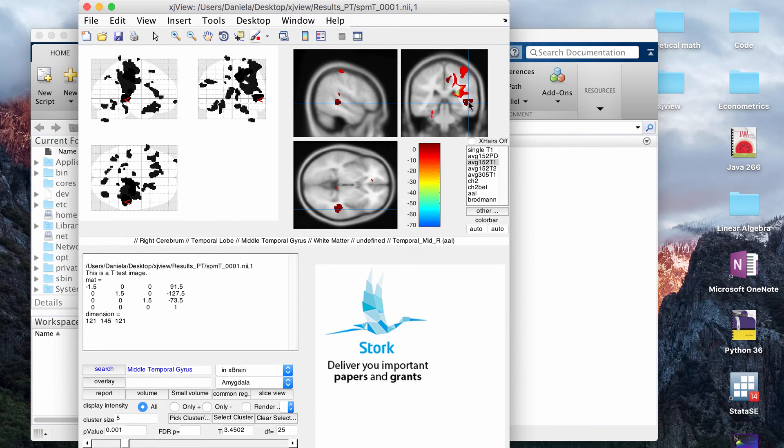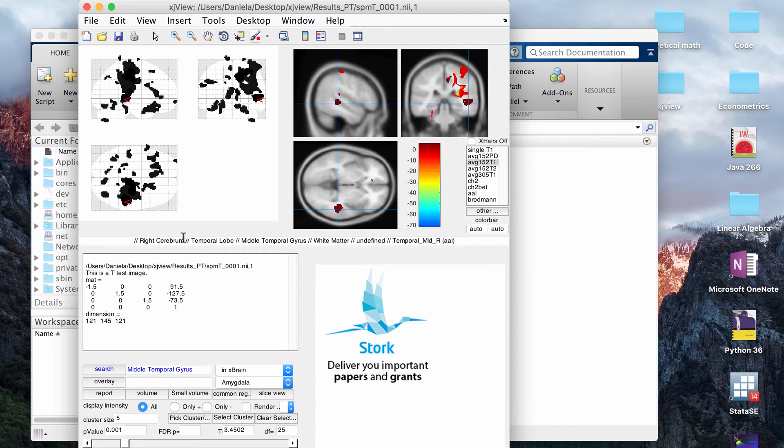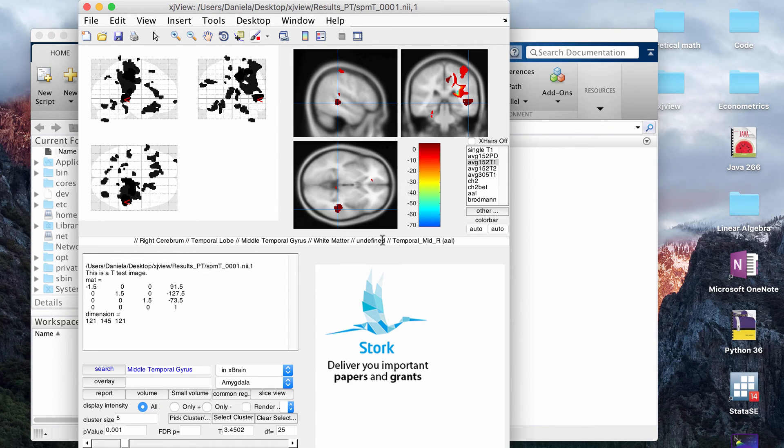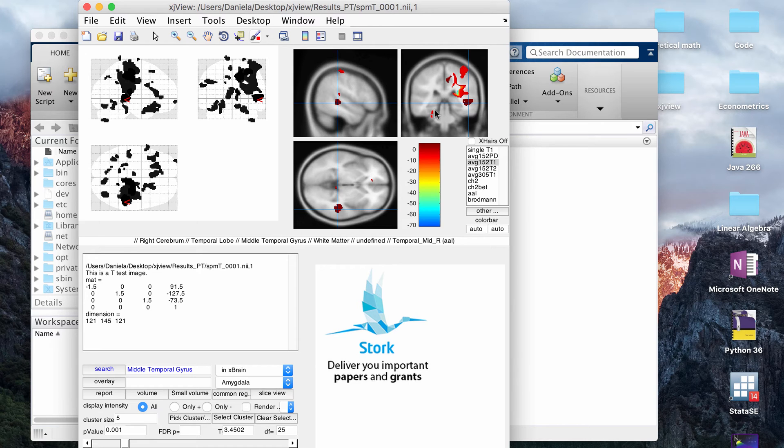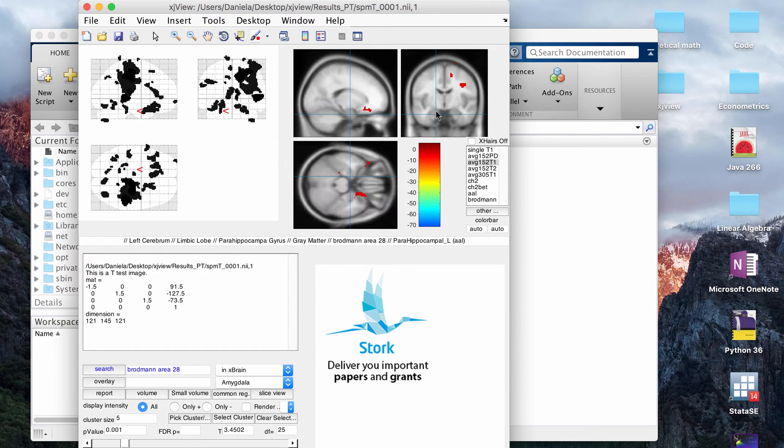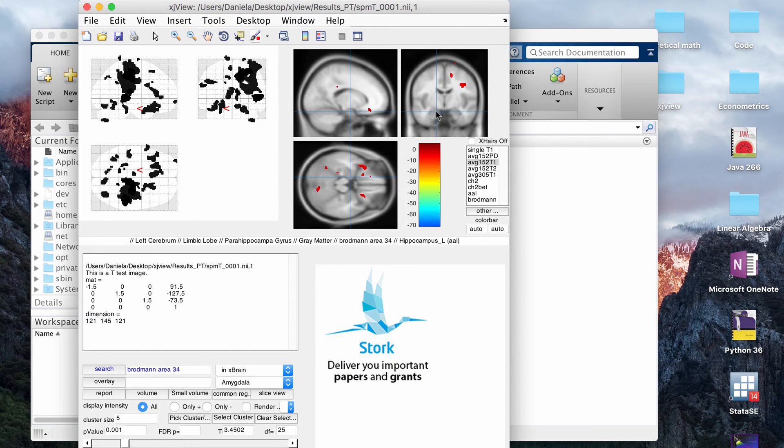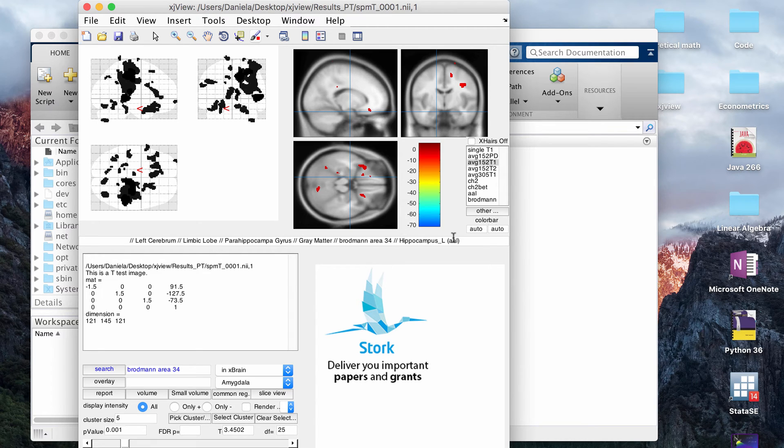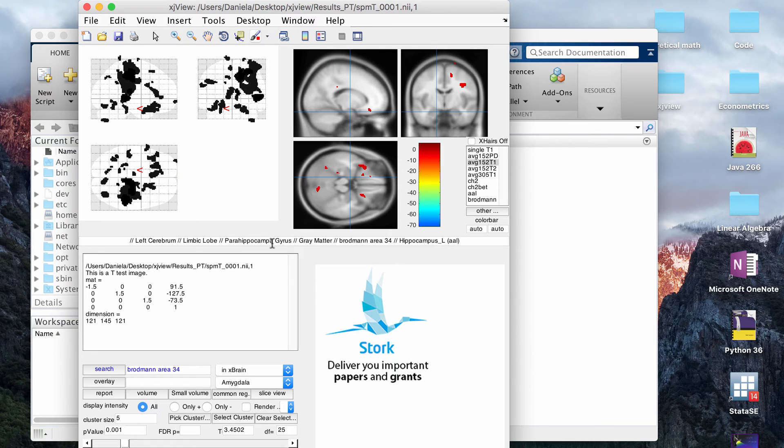I clicked here. It's telling me in the right cerebrum, so the right side of the brain. It's telling me it's in the temporal lobe. It's in the middle temporal gyrus. It's in the white matter and it's basically in the middle region of the white matter in the temporal lobe. If I try to find, for example, so that's the parahippocampus. If I click here, this is telling me down here now that it's the left hippocampus and that's the most specific. It's telling me I'm in the parahippocampal gyrus. I'm in the limbic lobe and things like that.